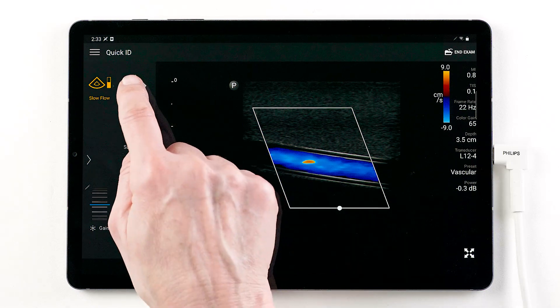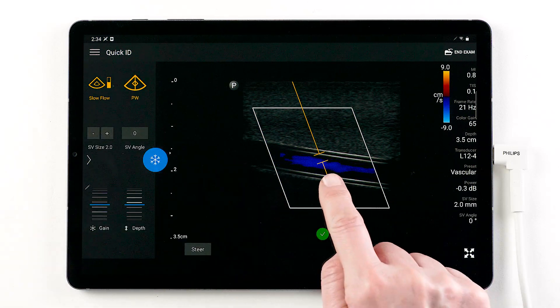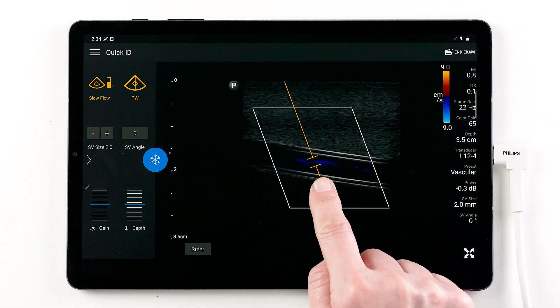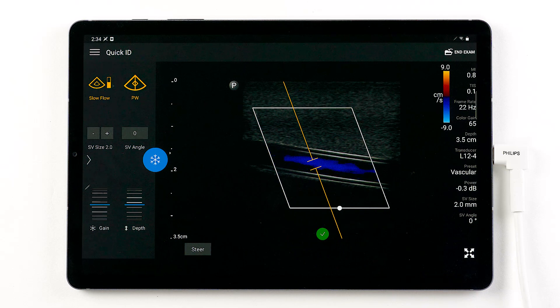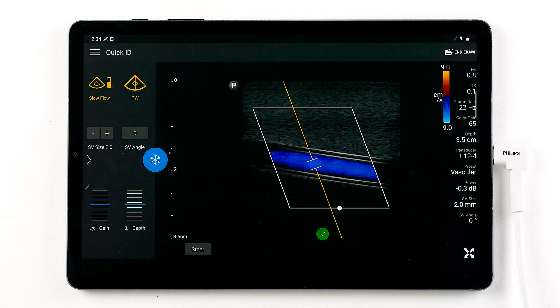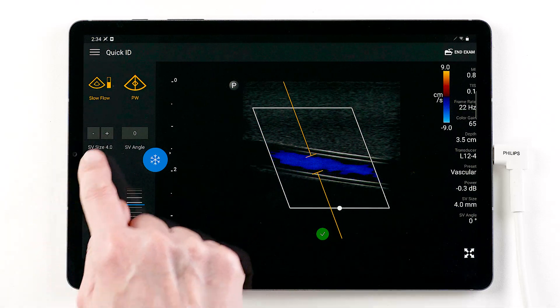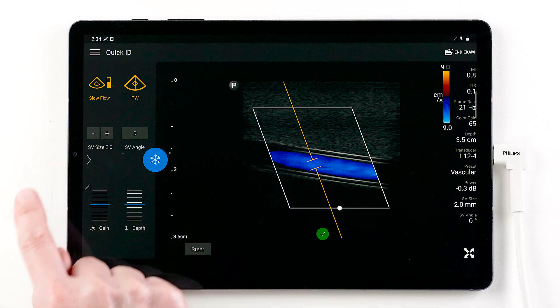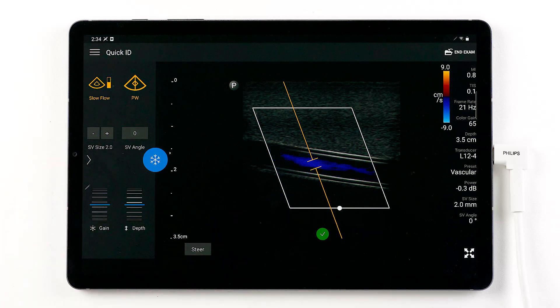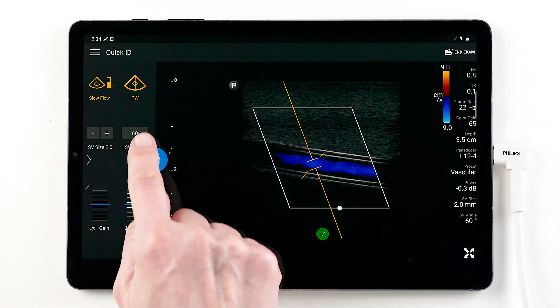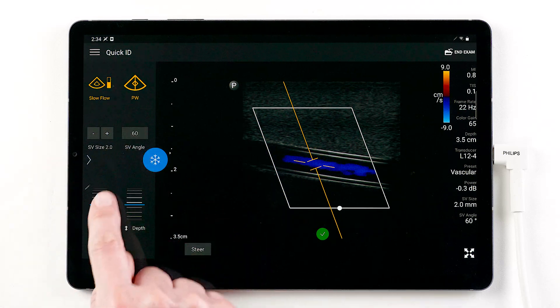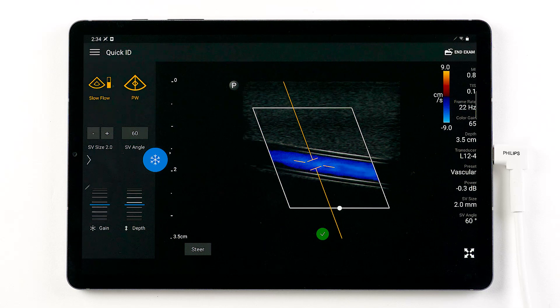Let's add pulse wave Doppler. The pulse wave line will follow the color box steering angle to simplify your workflow. While in pulse wave preview, you can adjust sample volume size, sample volume angle, and change your steer direction.